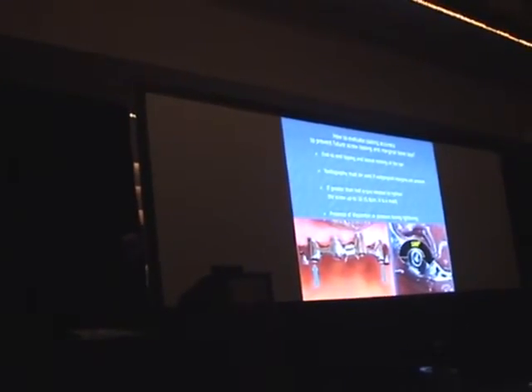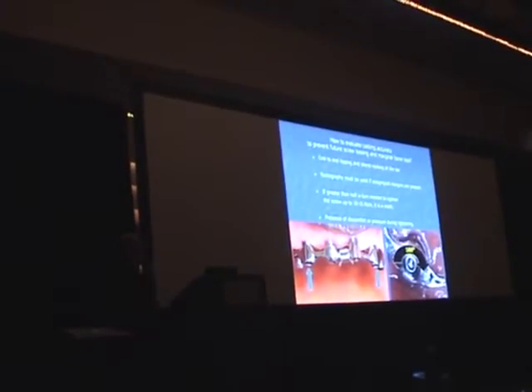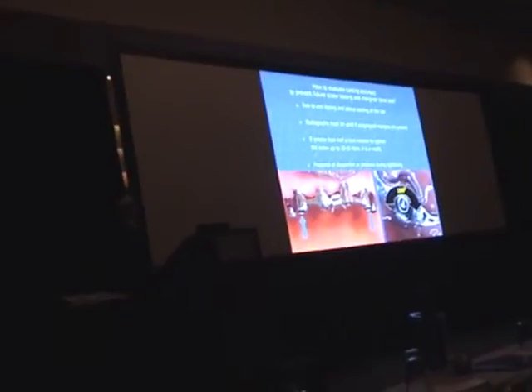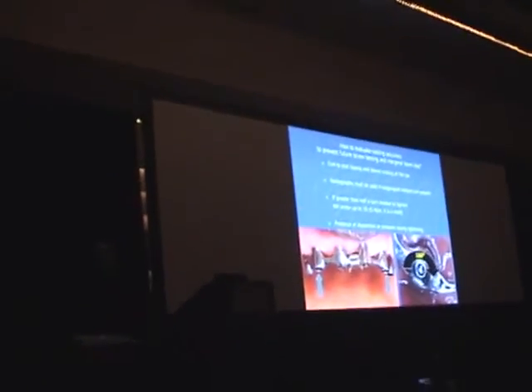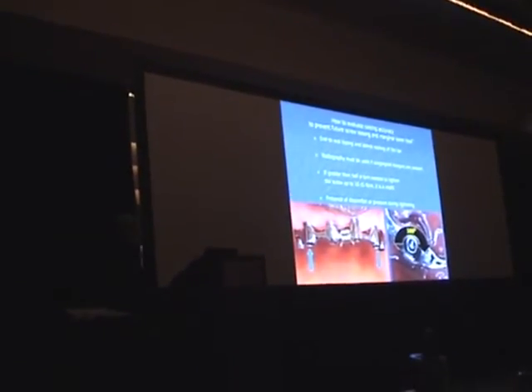Radiography must be used if some subgingival margins are present. Greater than a half turn is a problem: when you first encounter resistance of the screw while tightening, after the first resistance, if more than a half turn is needed to tighten the screw up to 10 to 15 Newton centimeter, it is a misfit. And presence of discomfort or pressure during tightening also indicates misfit.